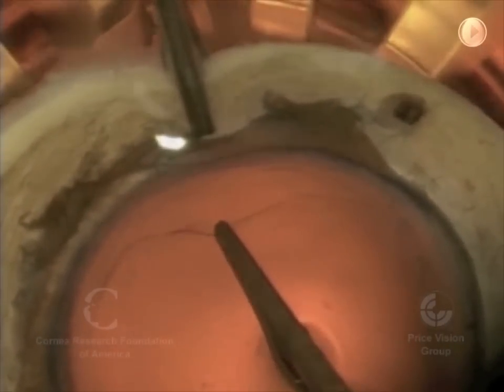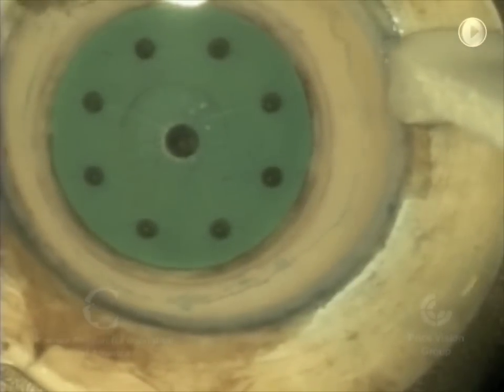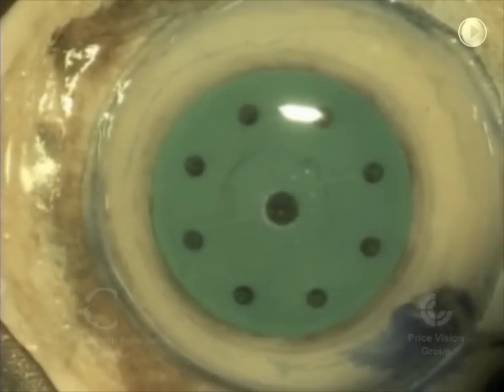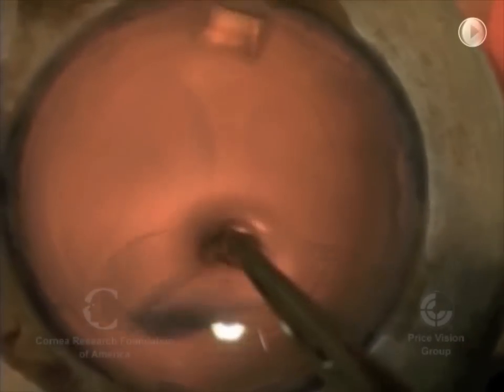After we've separated it evenly all the way around, we will place it on a cutting block and lightly punch it with a trephine. This will determine the diameter of the donor tissue we use in the patient's eye. At this point, we stain it again so that we can separate the outer part that's going to be discarded and save the inner part that we're going to tear off completely. And that will be what we actually transplant into the patient's eye.